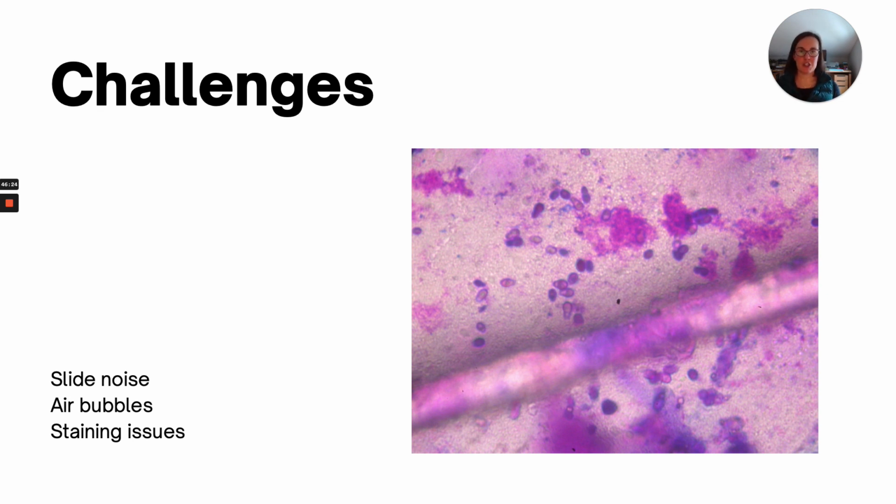So I really just want to sample, again, interdigital spaces are my go-to for tape preps. And so I'm sampling those areas, and also claw folds. Those are great spots to get tape. And then again, like I mentioned, your glabrous regions. But the question I have is pretty much going to be, is there yeast here? Yes or no? Because I do think yeast exfoliates really nicely on tape preps in these spots.